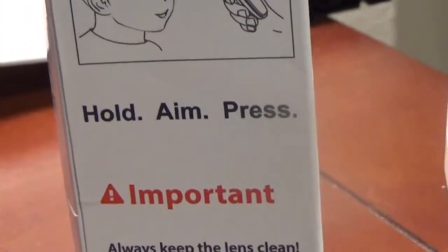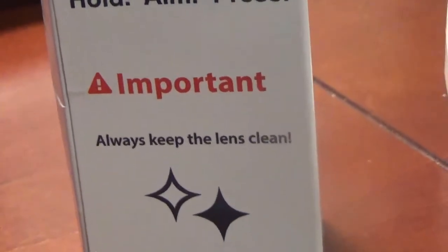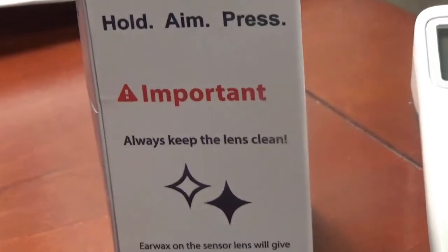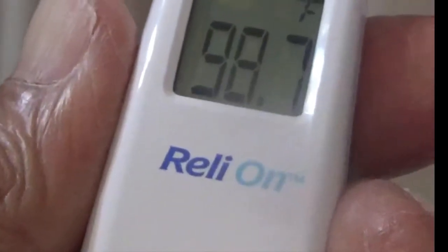You want to hold it within three centimeters — a little bit more than an inch — from the forehead. I usually try to keep it centered on the forehead, less than an inch. My reading with the contact thermometer we've relied on for a long period of time was 98.7, and then on the infrared it was 99.1.